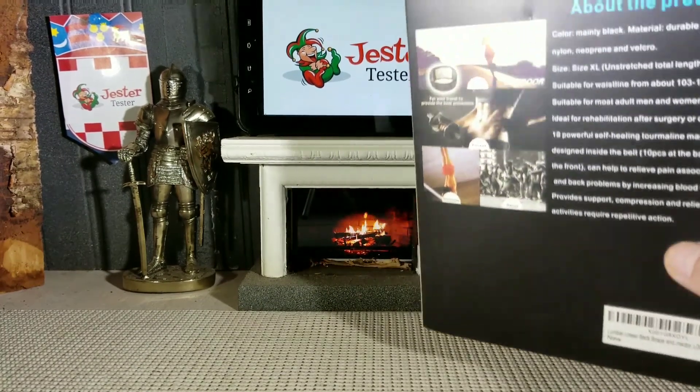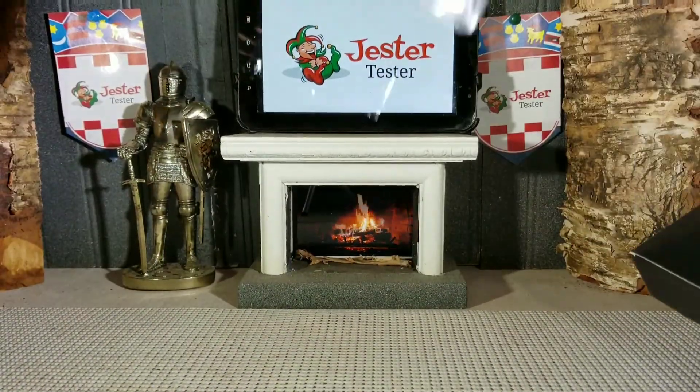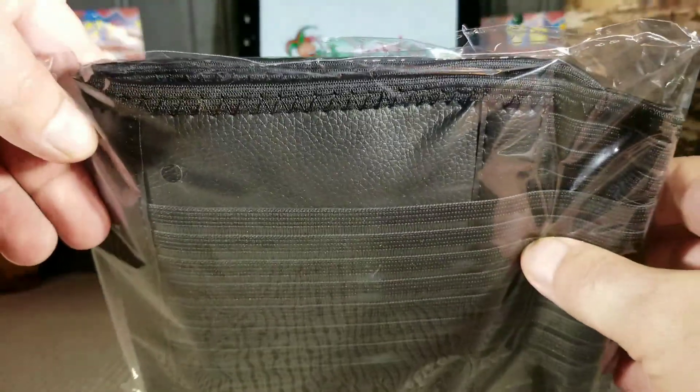And here it is guys — this is the way it comes. It comes in a box like this. Let's open it up and take a look at it. Alright, here it is. It comes in a bag.